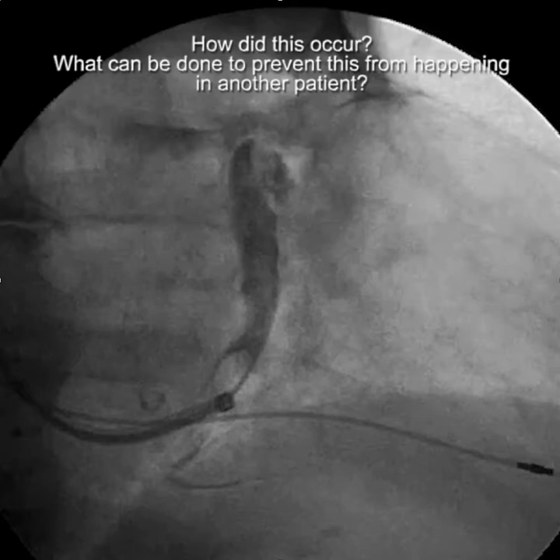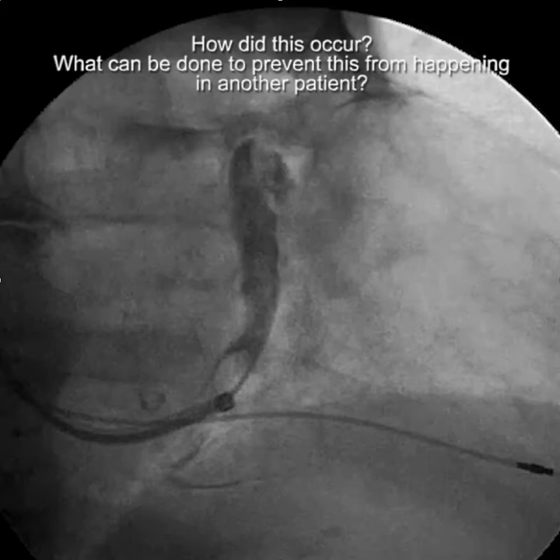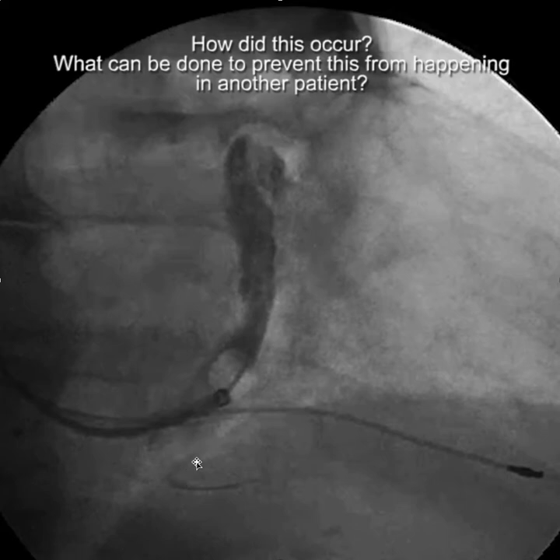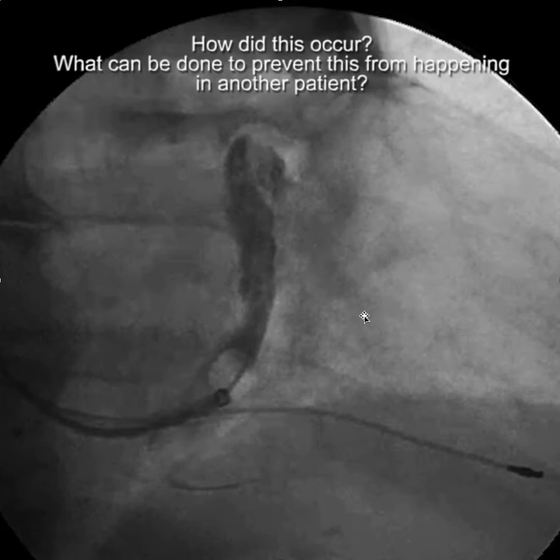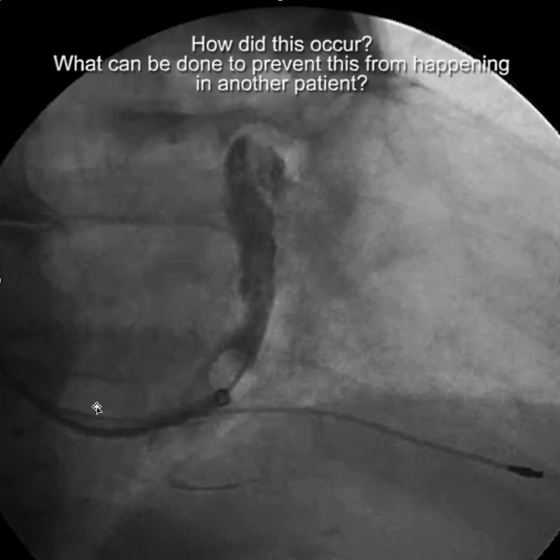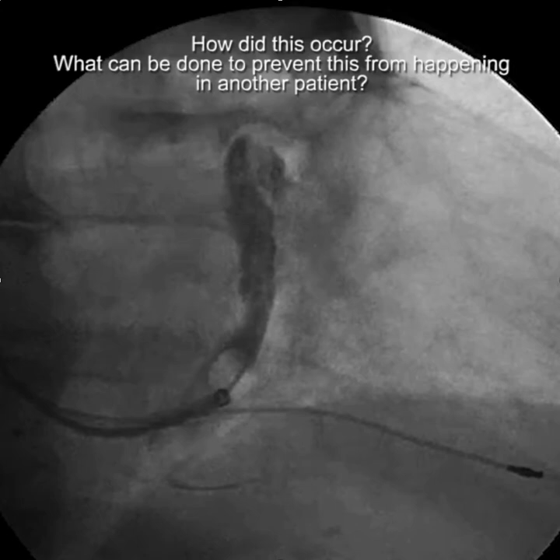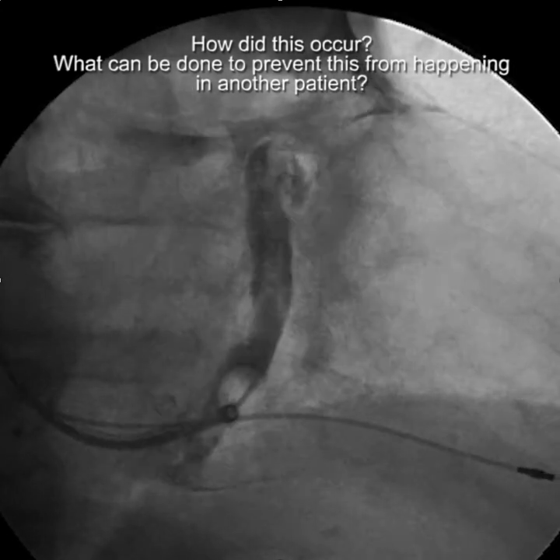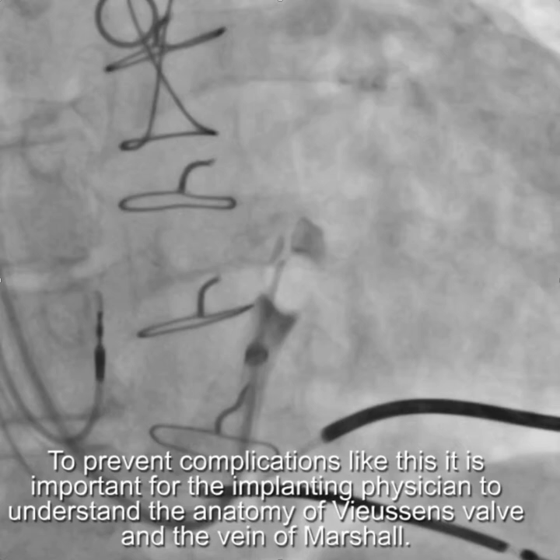Hello. This video demonstrates the importance of understanding the vein of Marshall and Vusensian's valve. When you see this, you wonder how did this occur and what can be done to prevent it from happening to another patient — an obvious CS dissection on venogram.